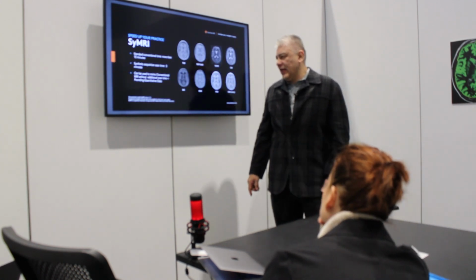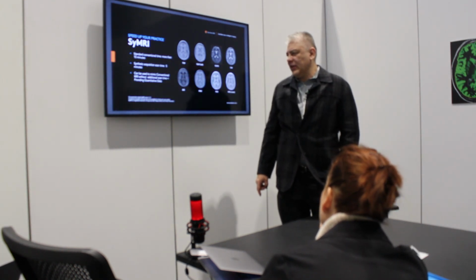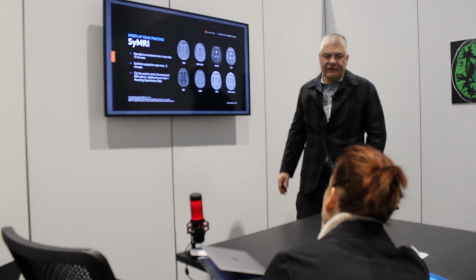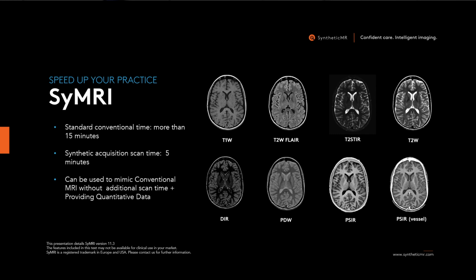You know, the sequence takes about 5 minutes, but if you have AI tools, it can take 3 or 3.5 minutes, meaning AIR Recon DL on GE, Deep Resolve on Siemens, or SmartSpeed on Philips. Acquiring this sequence can take about 3.5 minutes.